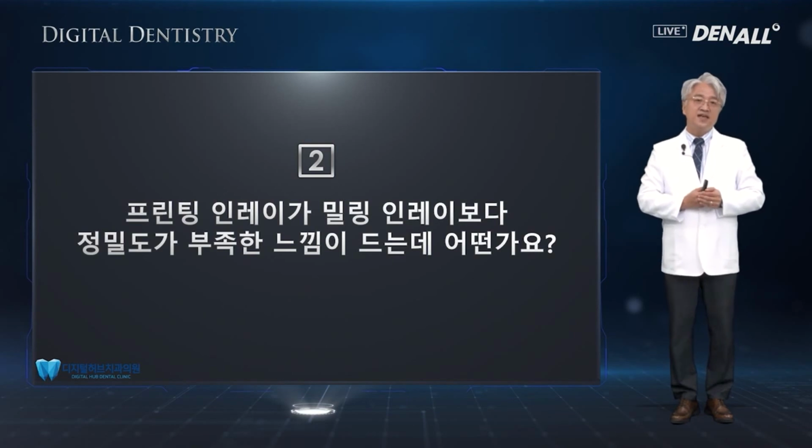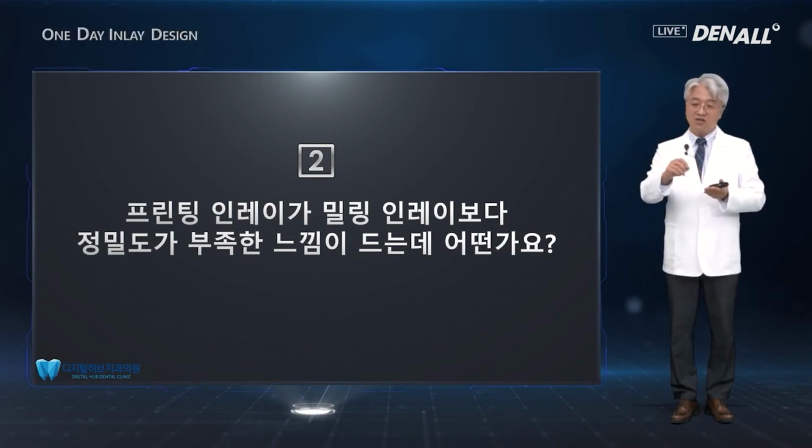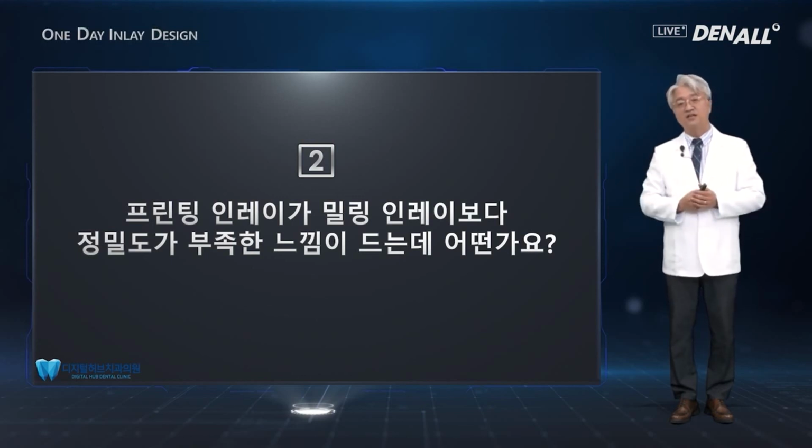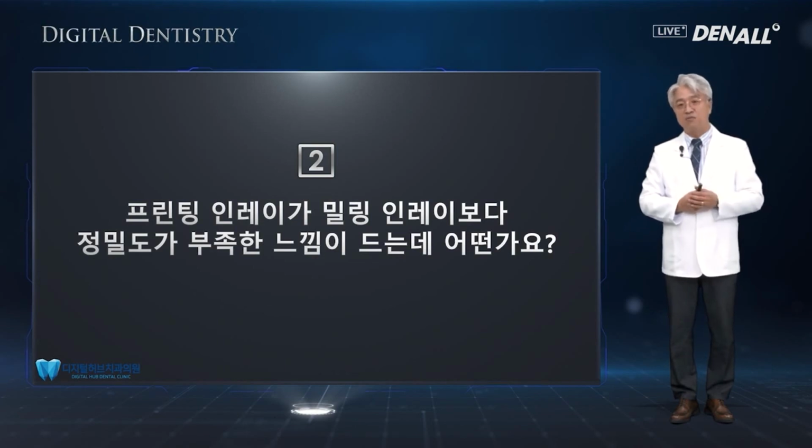But still, printed inlays come with other advantages. Mass production is possible, the production cost is low, and the time compared to milling is also shorter. And again, as you can make many inlays in one go, of course it might not be as precise, but I do believe going forward, printed inlays will be the preferred option.